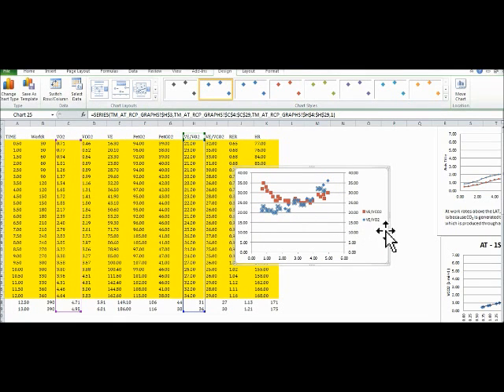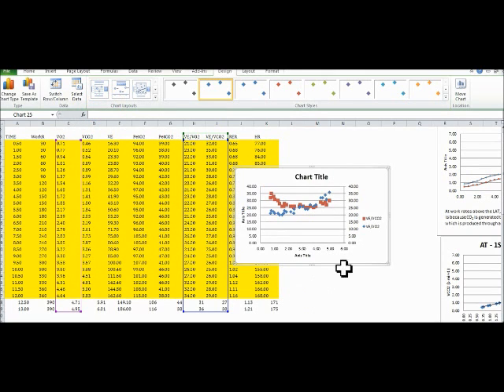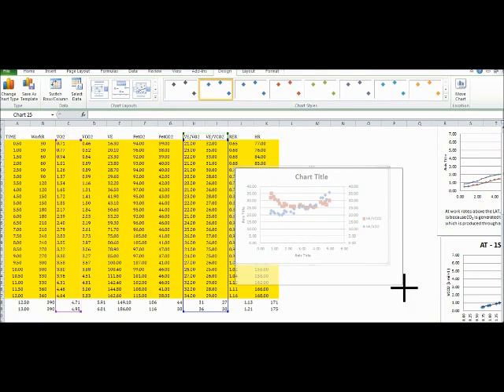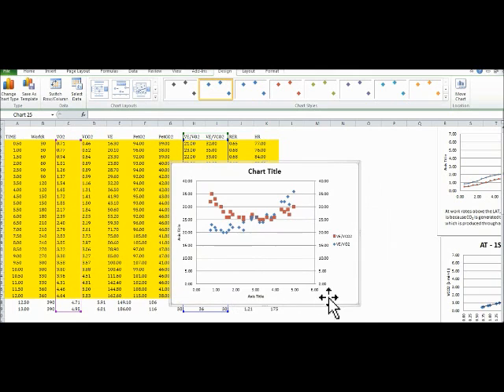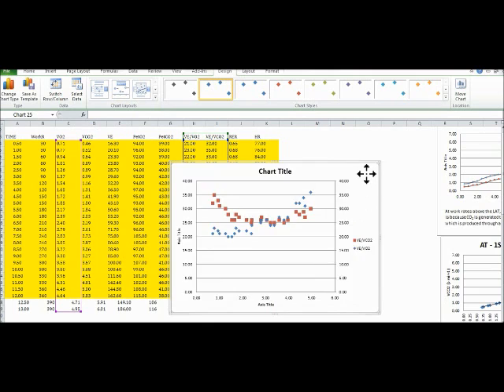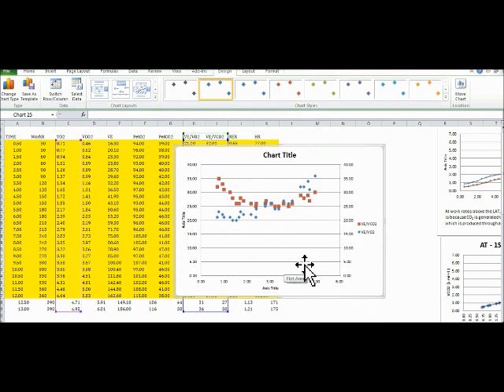So let's go ahead and close that. And also, we definitely want it to be more aesthetically pleasing, so let's do that. And we can blow it up. Again, we want to label it right away. I'm not going to label it just for time's sake, but make sure that you label it along with your axes. Since we clicked VE/VO2 and added the axis, the right axis is the one that corresponds to VE/VO2. The left one corresponds to VE/VCO2.